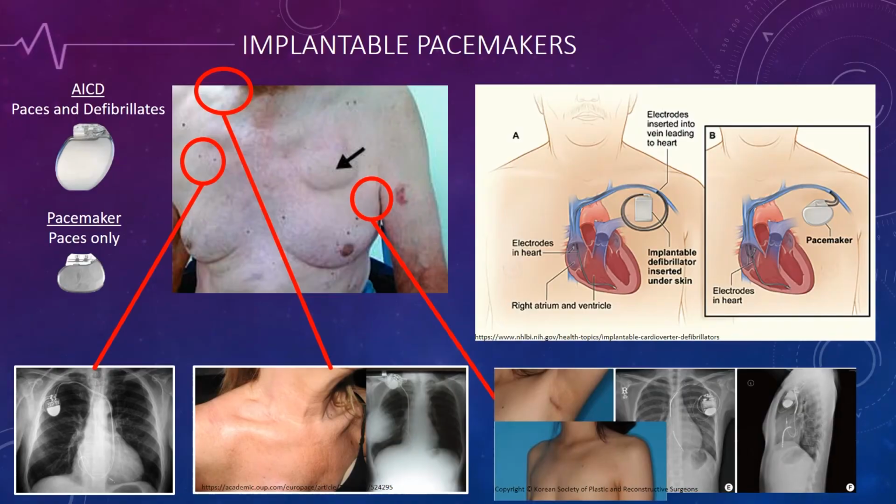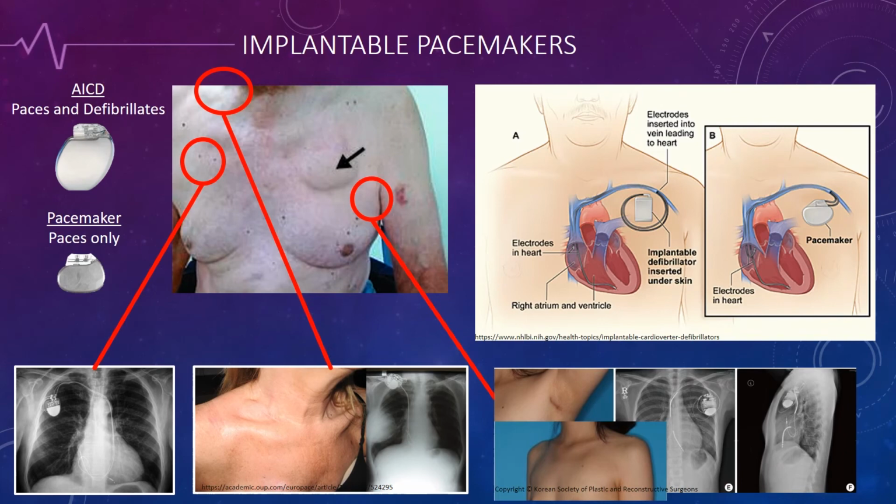Okay. Implantable pacemakers, I do these. You'll usually find them here, but honestly, that's on its way out. The pacemakers that we have now, the brand new ones, they go in through your leg. They're the size of a .22 bullet, and I inject it directly into your heart. They are magnificent. So you'll see no pacemaker wound with those. There's no evidence externally that a patient has one. What you'll see is a thing that looks like a little bullet in the tip of their heart.